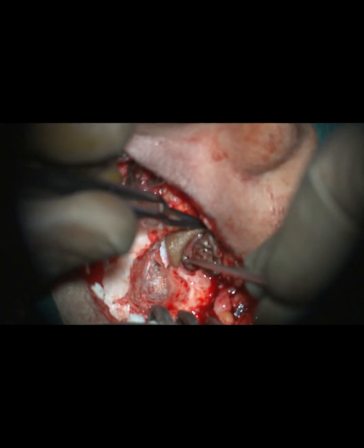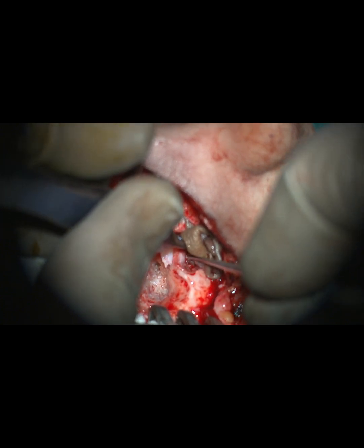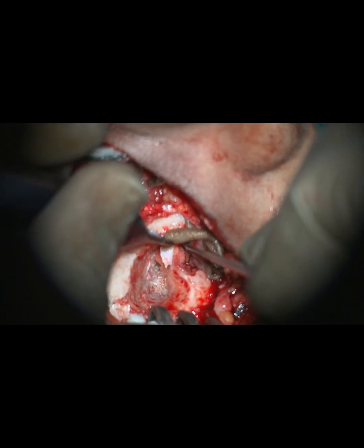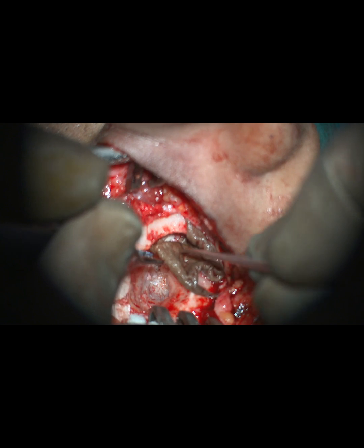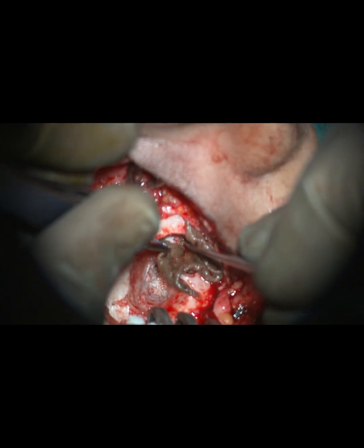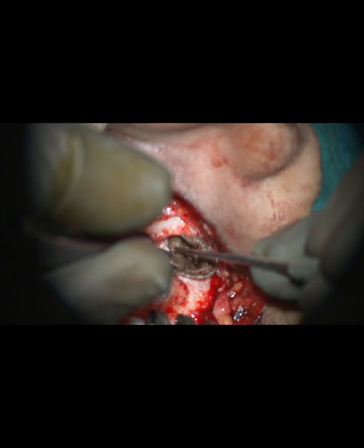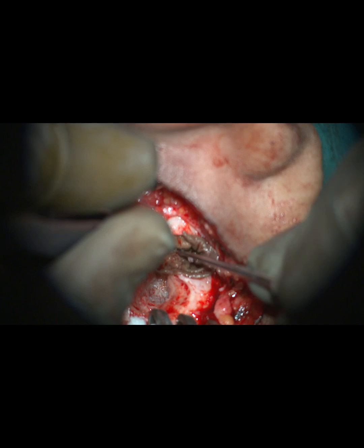It is important to ensure that there are no folds, because otherwise there will be high chances of cholesteatoma formation. After covering the raw area of the bone all around, we place a medicated gel foam within the newly formed canal so as to again avoid displacement of the graft.